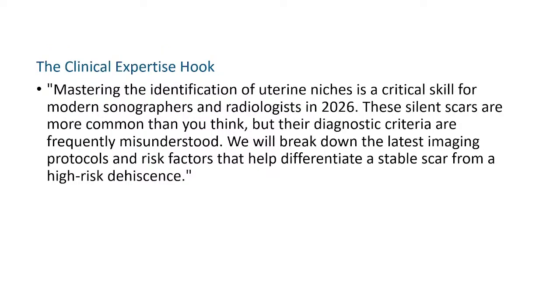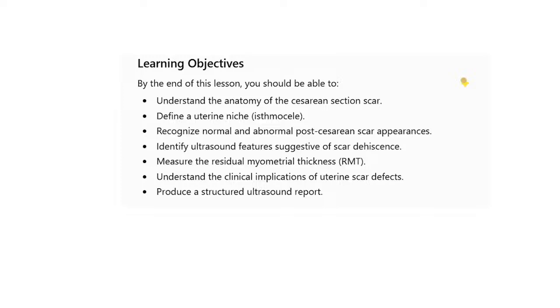So the clinical expertise hook. Mastering the identification of uterine niches is a critical skill for modern sonographers and radiologists in 2026. These silent scars are more common than you think, but their diagnostic criteria are frequently misunderstood. We will break down the latest imaging protocols and risk factors that help differentiate a stable scar from a high-risk dehiscence.